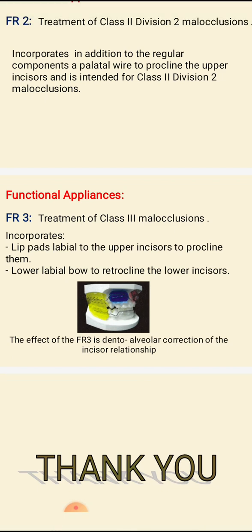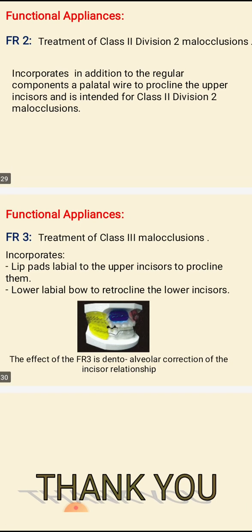Any removable functional appliance is worn about 14 to 16 hours per day. This includes all the removable functional appliances. And the patient can use it at bedtime, in addition to some extra hours to complete the 14 or 16 hours.